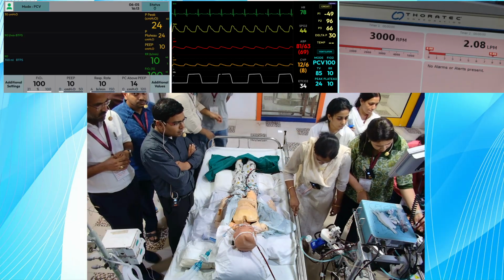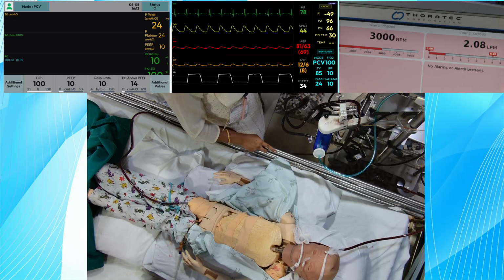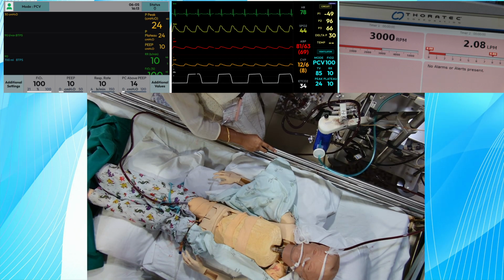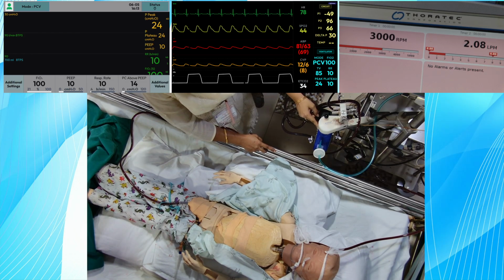And this is on. What is there between? There is no oxygen in the oxygen cylinder. The pressure gauge must be showing whether there is oxygen or not. That's a good differential diagnosis. I agree. Next time keep that scenario in mind.